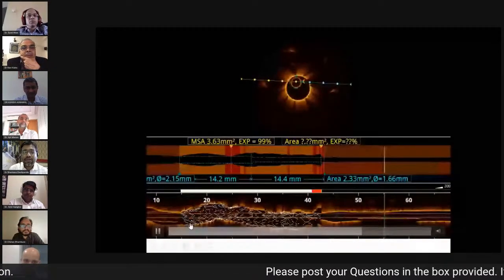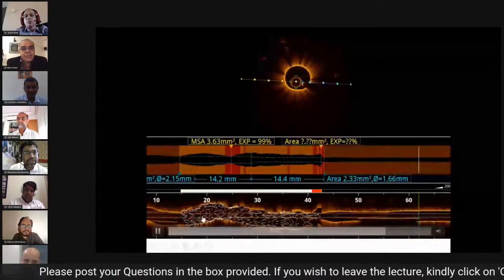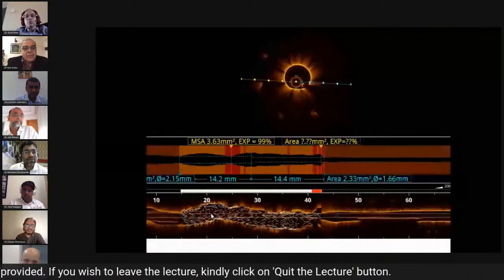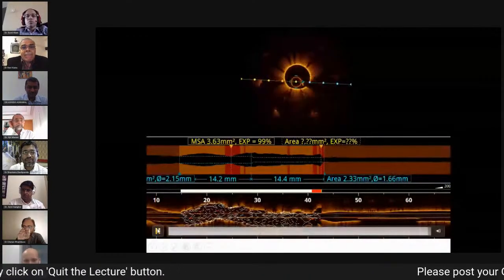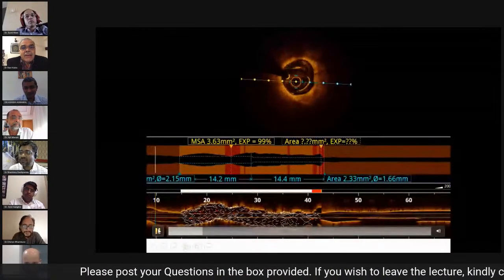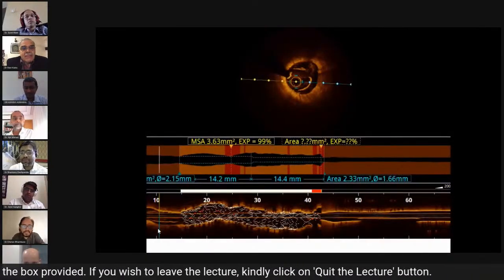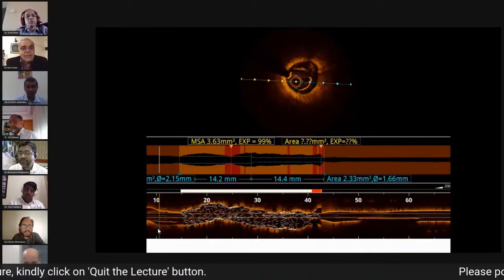Yes. So, did you cover the whole proximal stent even with a new stent? No, sir. We actually thought about doing something like an OPN balloon here, but then there was this calcific spur, and we had already gone to 26 atmospheres with the NC. So we thought we would stop at this moment. That is probably for the expert panel to answer, whether we should have gone with an OPN balloon here.